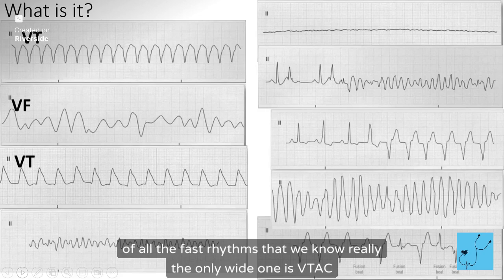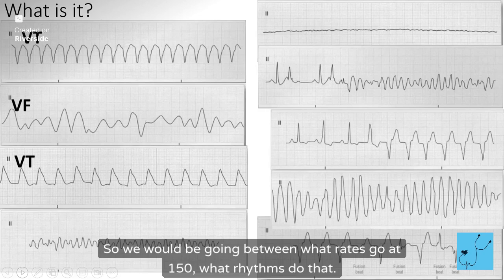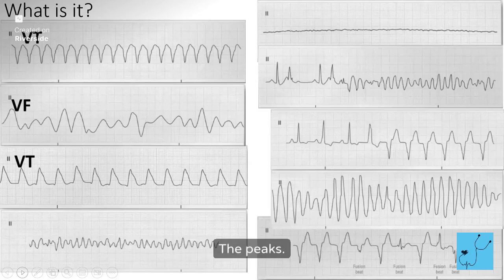And of all the fast rhythms that we know, really the only wide one is VTAC. So we would be going between what rates, at 150, what rhythms do that? Not SVT. To count it, you count the peaks, right? Like peaks. Okay.